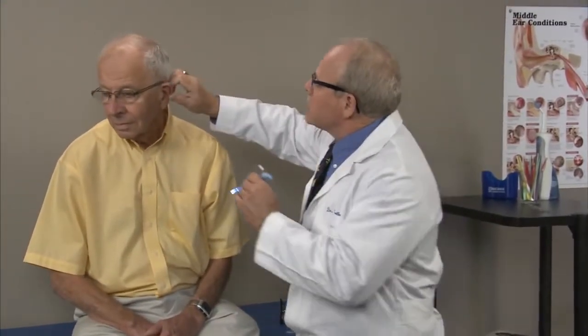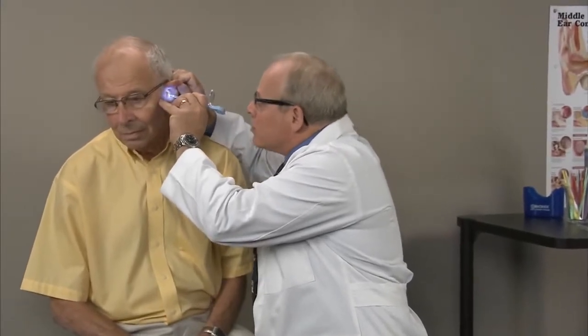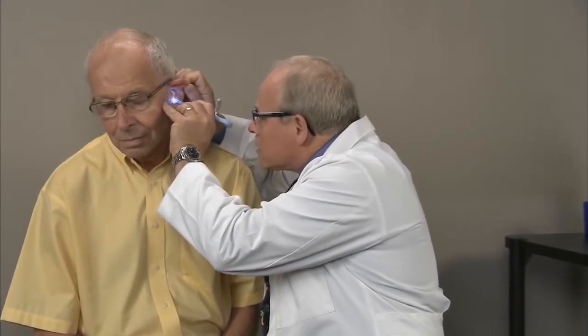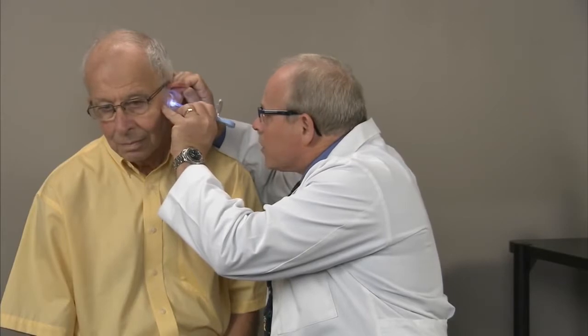I want to position the head, extend the ear canal, and look in using my lighted ear curette and magnifying lens. I can see exactly where that wax is and very specifically, very gently remove it from his ear canal without causing any pain or damage.